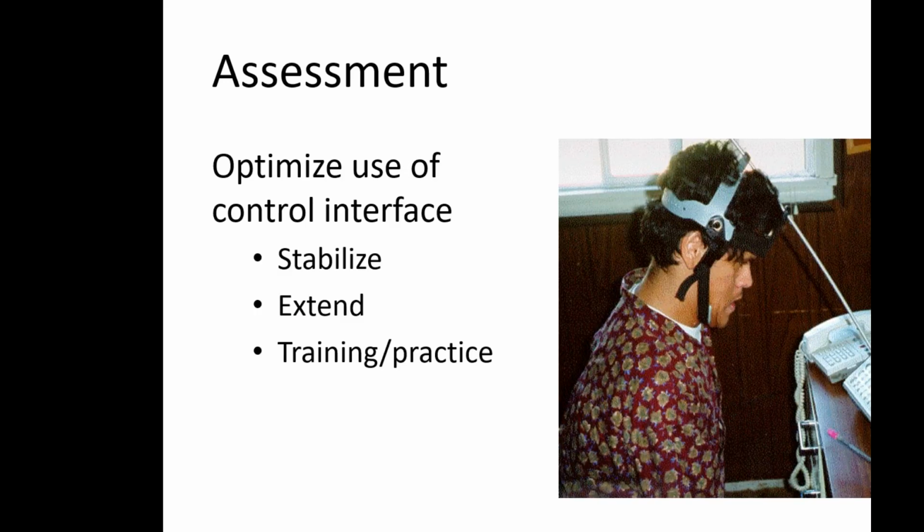Okay. As part of this assessment, we also need to look at making sure that the control interface is stabilized, it's positioned where we need it to be positioned, and that we also provide plenty of training and practice opportunities to the user to make sure that this truly is the best match for the user.